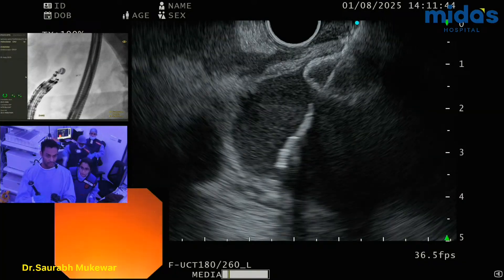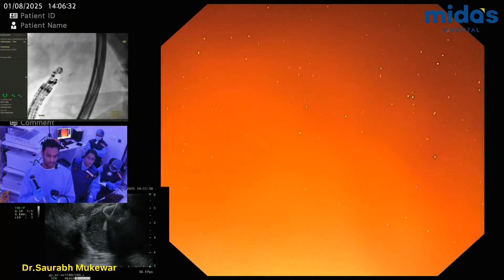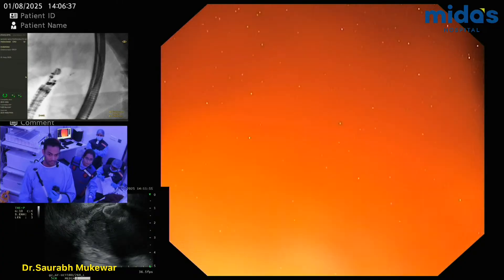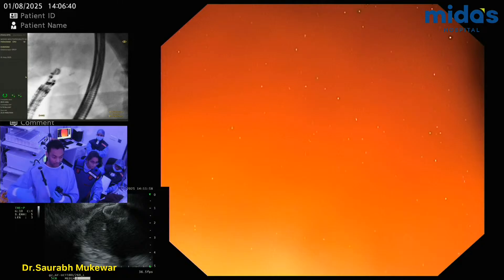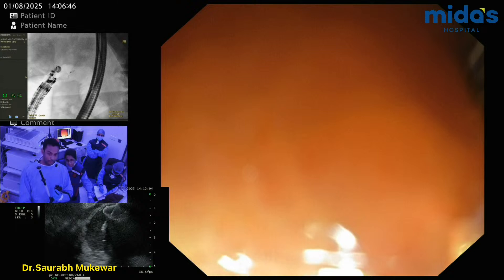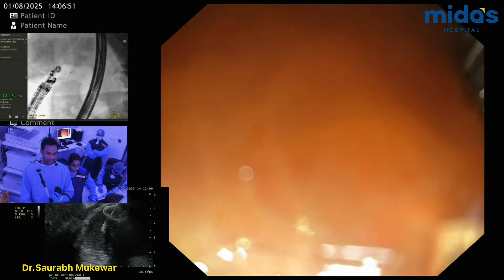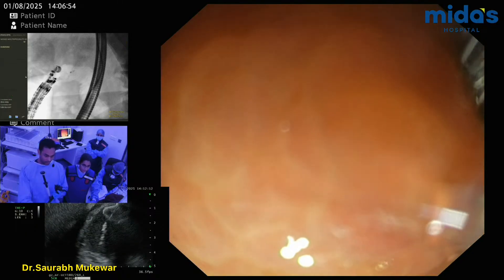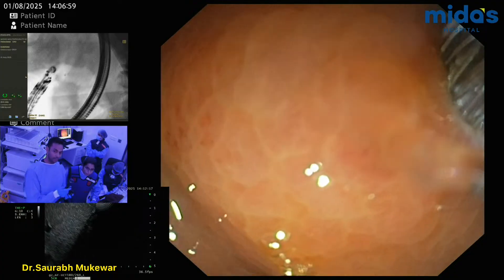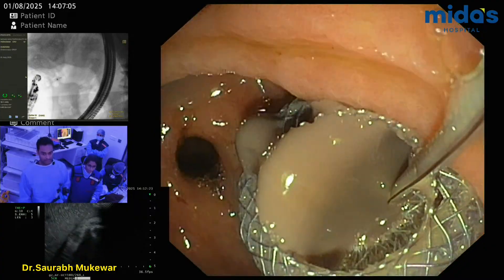Now I'm going to unlock it. Put some CO2. Down. There you go. And then, gently pull the scope back. Because now you're — you see on the fluoroscopy — the scope is in a loop position. So when I pull the scope out, you may just yank it — you don't want to do that. Just a little bit of maneuver to be away from the wall, but not removing the entire scope. And then I'm going to push and I'm seeing the stent. A little maneuver — counter-clockwise. There you go. Pus. So that's it. That's the way you do it.